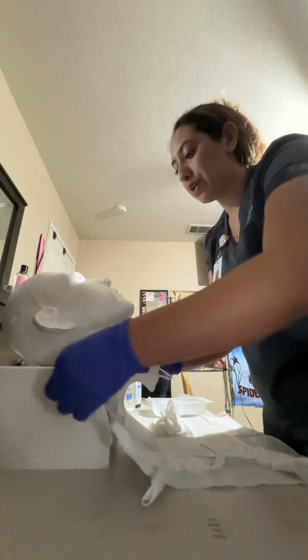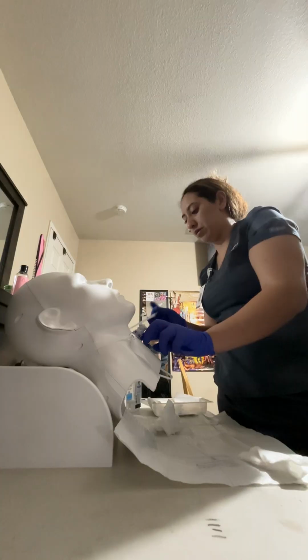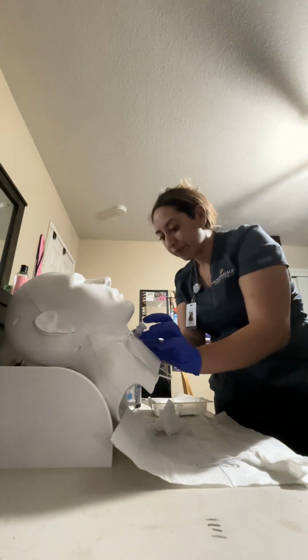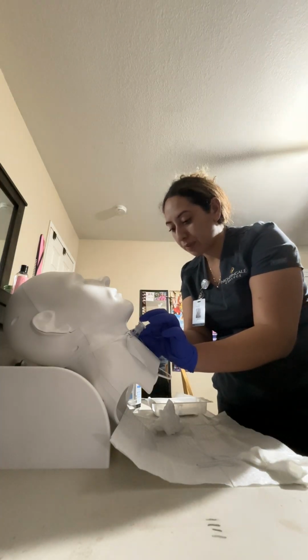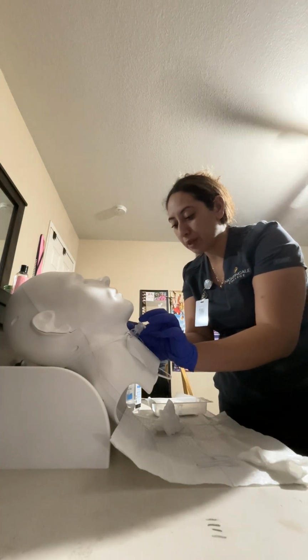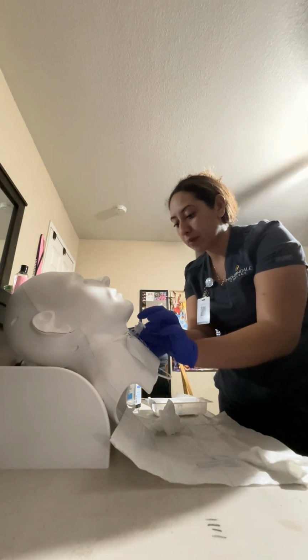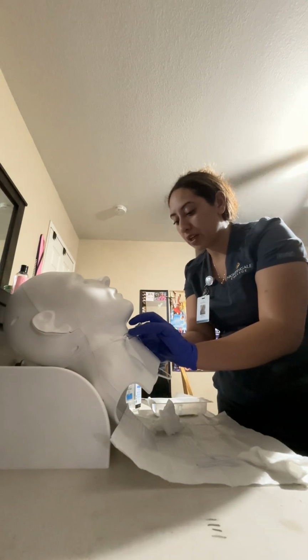Okay, I'm going to ask my patient to go ahead and lean forward for me. Bring this around. Ask my patient, are you doing okay? Patient says he's doing okay. So I am almost done here. Going to tie these.